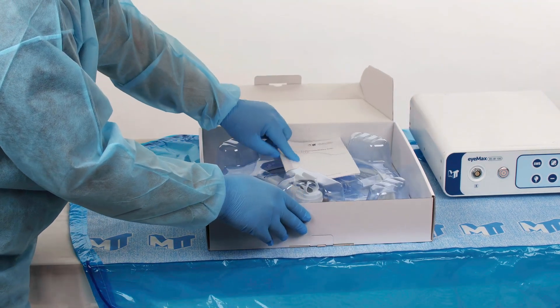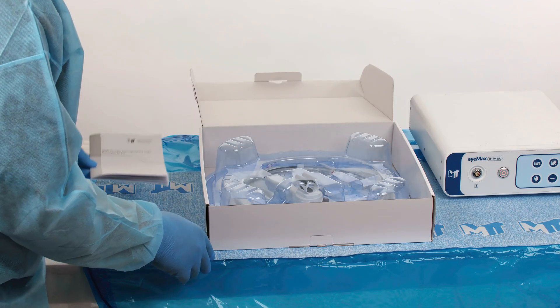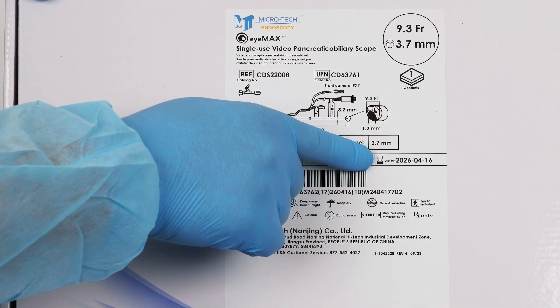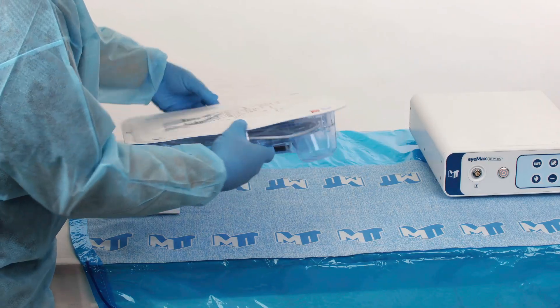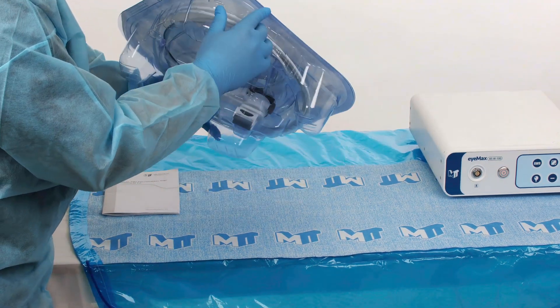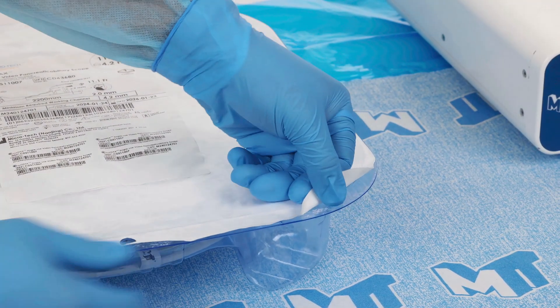Before using the IMAX scope, it is important to read the instructions for use in its entirety to ensure safety and functionality. Prior to use, inspect the expiration date on the package and choose a scope that has not expired. Ensure that the sterile packaging is intact and free of damage, holes, or tears. Do not use the IMAX scope if the packaging is damaged, as sterility may be compromised.